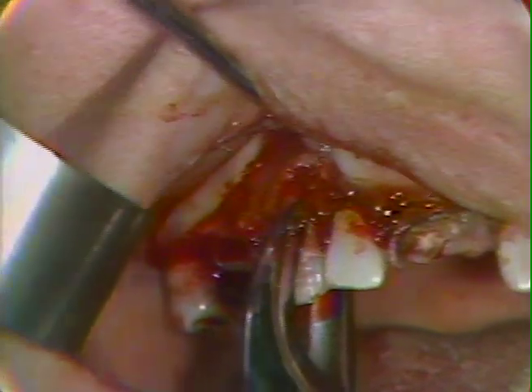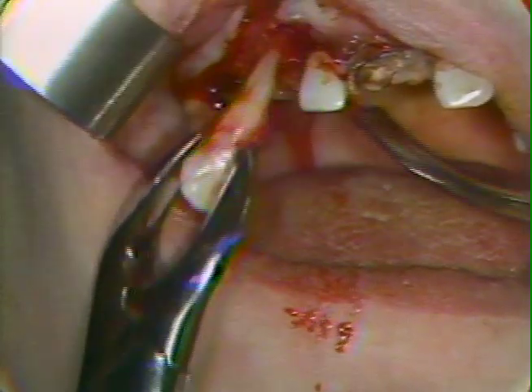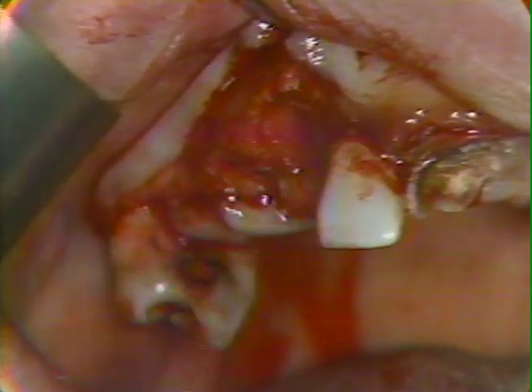We next will approach the cuspid and again apply these beaks in a similar manner. The cuspid is a conically rooted tooth, and we shall try to give it some rotation in the same manner. The cuspid is rather long, as you can see, but we have not fractured any of this alveolar process. So by reducing some of the reinforcement of it, we actually have conserved bone.